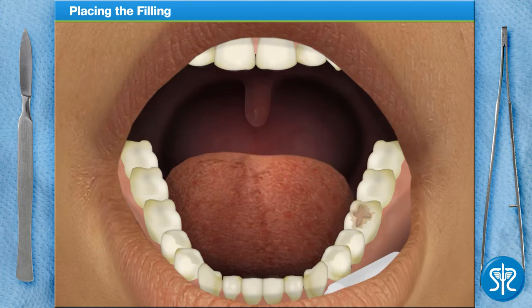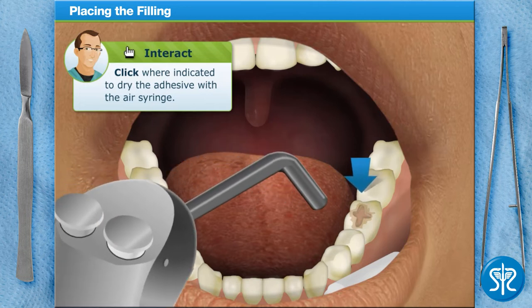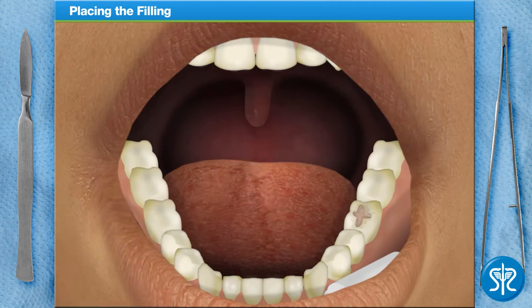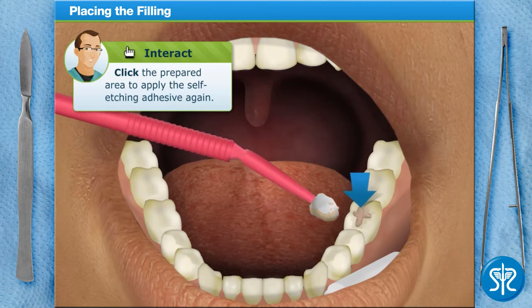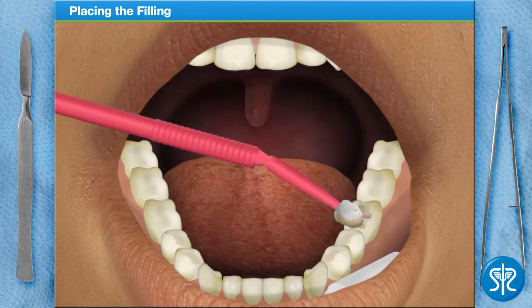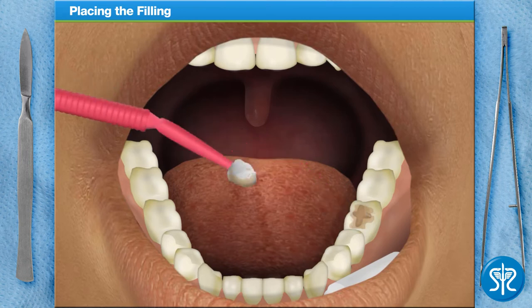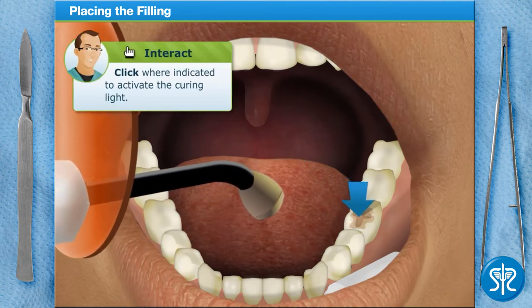Now dry the area using the air syringe. Next, you'll need to apply the self-etching dental adhesive to the prepared area of the tooth one more time. Then use the curing light to harden the self-etching adhesive.